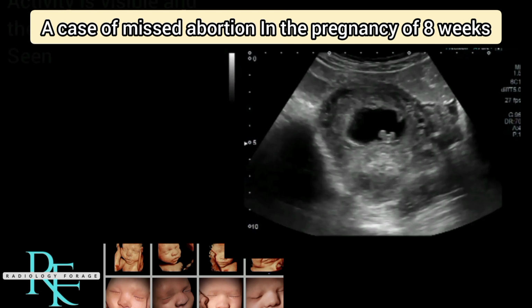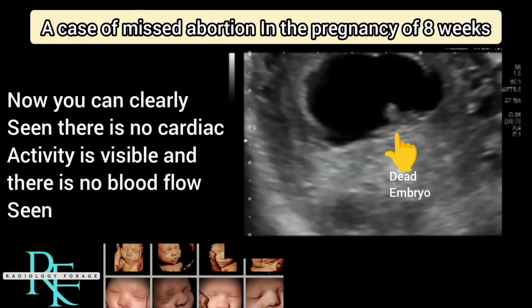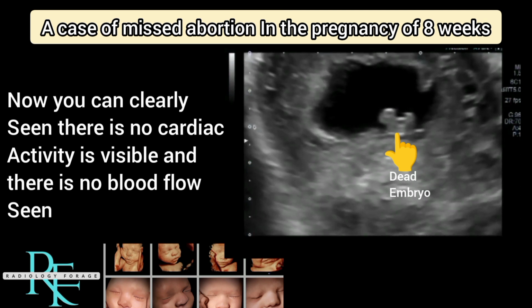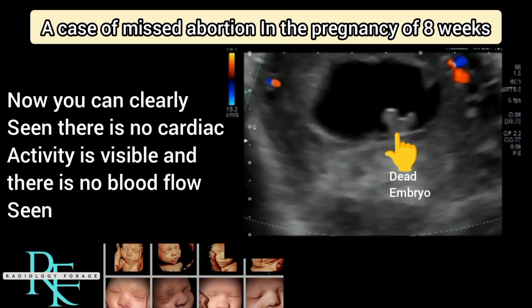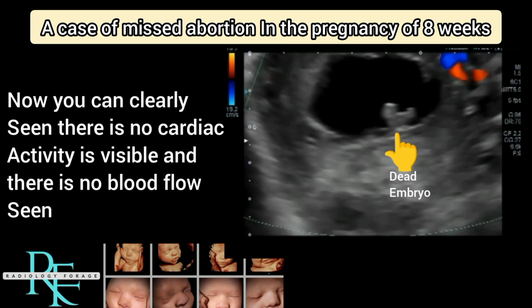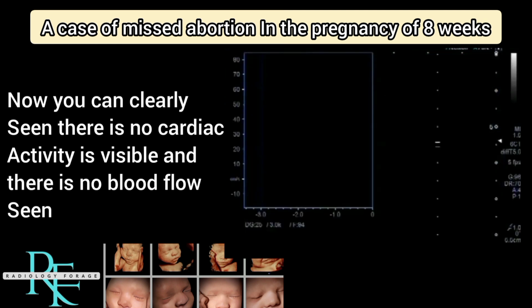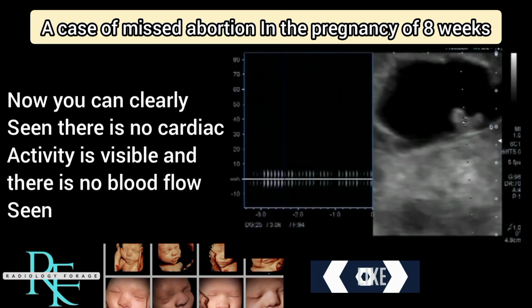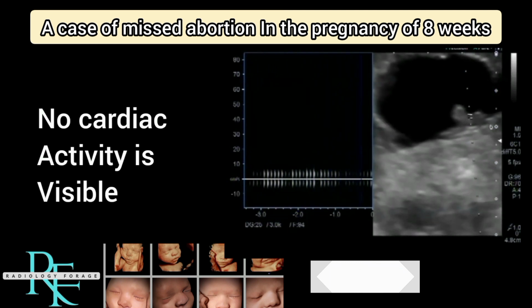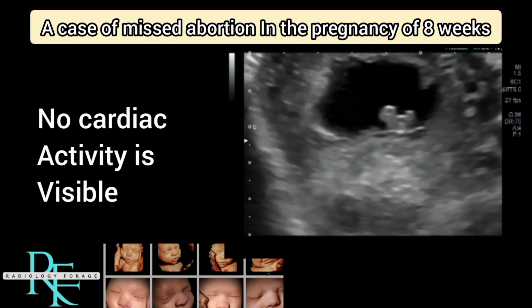I will try to zoom it and show you. This is a dead embryo. I have zoomed this picture. Now you can clearly see there is no cardiac activity visible and there is no blood flow seen. No cardiac activity is visible in this scan.